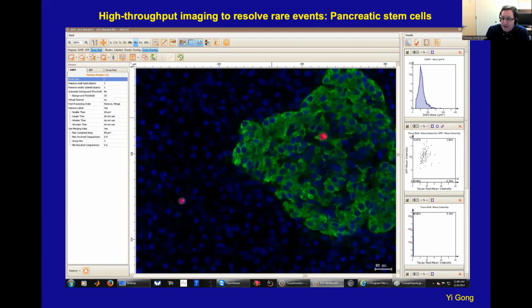And so in this case, we were scanning many, many pancreatic tissue sections trying to find and characterize these very, very rare events. I've had cases where we have different methods to localize cells, of course, like flow cytometry and so on. Sometimes we have T cells. There was one study where we were looking for a phenotype that was 1 in 10,000 cells. So it was extremely rare.